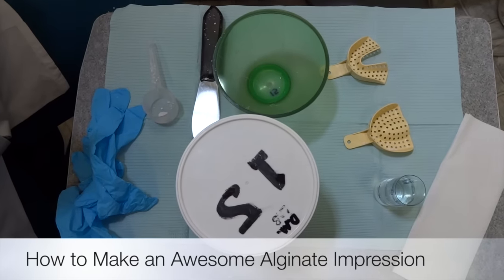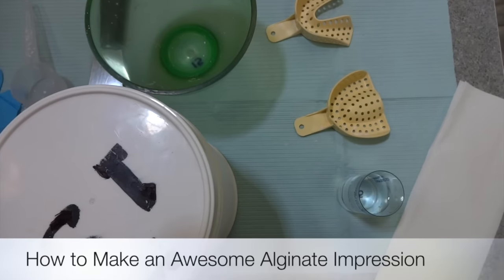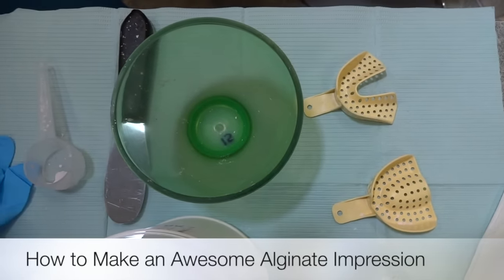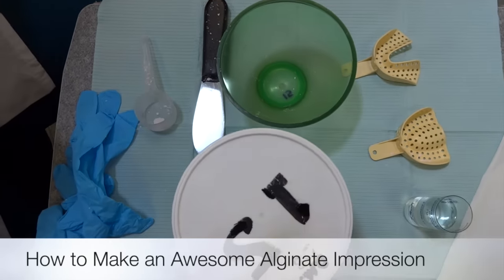Today we're going to show you how to make a good mix of alginate. The most important part of an impression is having a good, smooth mix of your alginate, and that'll really help make your impression clear and diagnostic.